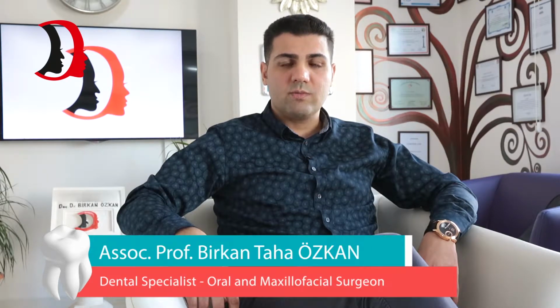Initially, I measure the bone volume in the missing tooth region in which the implant planning is made. In most cases, I do not use computerized tomography for the feasibility of implant insertion, just to avoid unnecessary radiation doses. I recently use special calipers and panoramic radiographs for the bone measures in the region for implant insertion. This is generally sufficient for implant insertion.